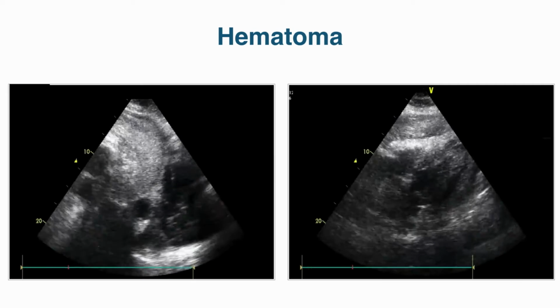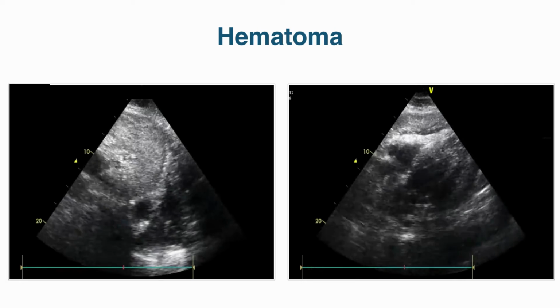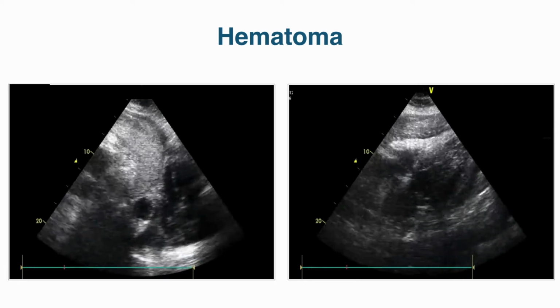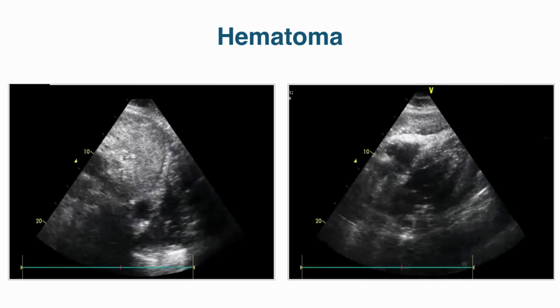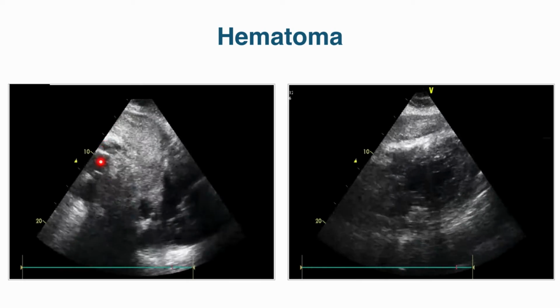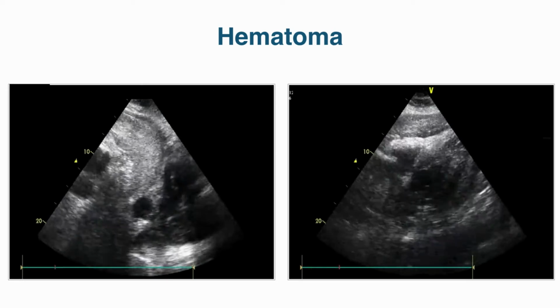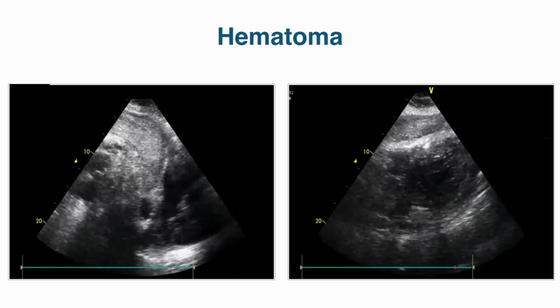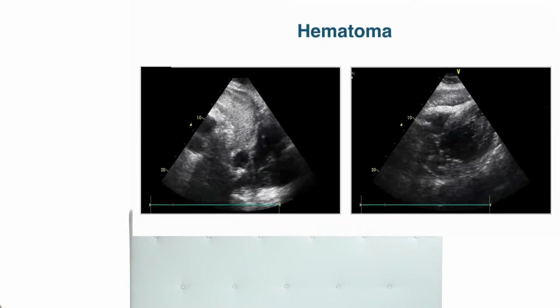And here's an example where you have a lot of fluid suddenly expanding into the pericardial sac in a patient who had rupture of the aortic sinus. You see that we still see the free-flowing blood right here, and this definitely causes a tamponade. You don't even have to check for the signs of tamponade. If you see this, you better run.